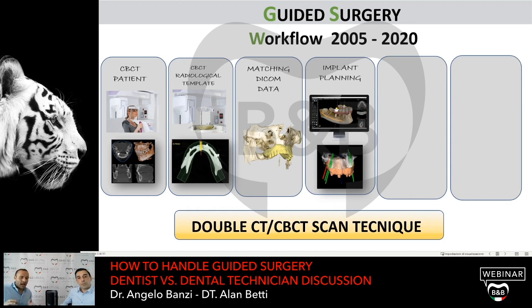Every type of abutment requires a different position of the implant, and having its proper position, and having a well-done guide that matches with the final position of the teeth of our rehabilitation, is the first important thing that this system requires.